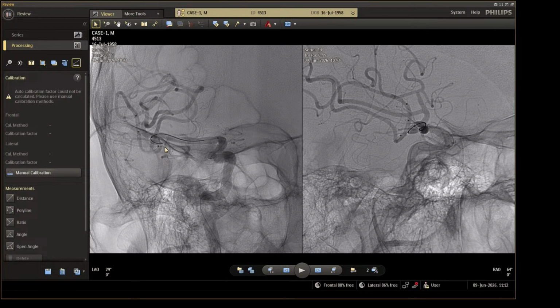I prefer Hyperglide 4x15, Eclipse 6x15 and Scepter 4x15. It's inflating like a sausage and not bulging too much inside the aneurysm neck, compared with the Scepter XC and the short length Eclipse 6x9, 6x7.